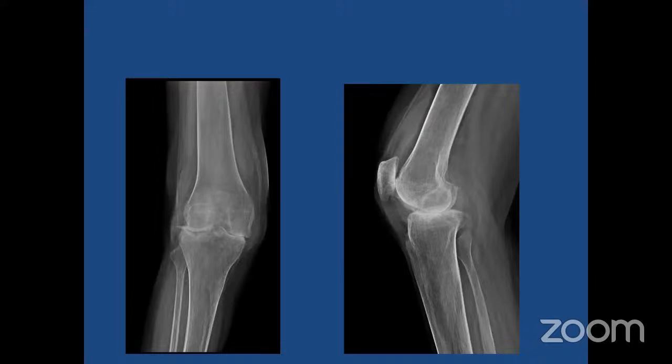So I think that is something that we can see here. And I think others have already covered the rest, so we can leave it at this. I mean, the pre-op X-ray looks like about 15-20 degree FFD. So even if you get about 10 degree FFD at the end of the procedure, I think we can accept that and expect it to correct over time.